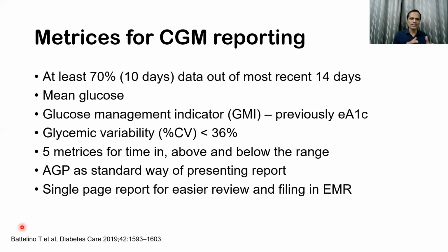The guidelines do also suggest a practical tip of having a single page report for easier review and filing in the electronic medical record.